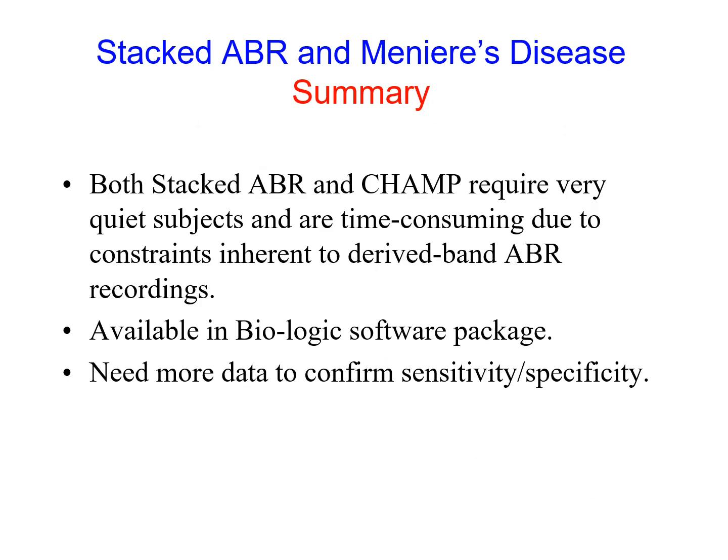This slide is a summary for stacked ABR and Meniere's disease and how to use it to help diagnose Meniere's disease. Both stacked ABR and CHAMP require very quiet subjects, and both are time-consuming due to the constraints that are inherent to derived band ABR recordings.